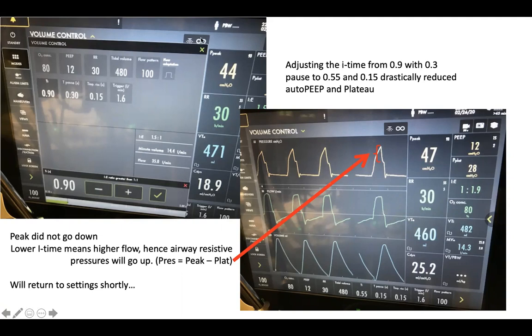You may notice that the peak pressure actually went up, and this is expected because by lowering the inspiratory time for the same delivered tidal volume, that means that there's a higher flow rate required to get that breath in quicker.